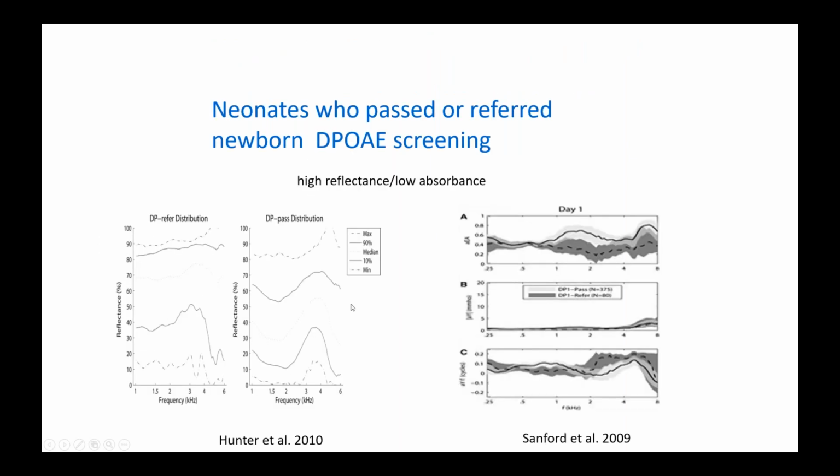Now, these are some of the tests that have been done, like Sanford and Hunter. They were one of the earlier studies that studied the absorbance in infants who passed or referred in a DP-OAE screening test. And Sanford has given the results in terms of absorbance.